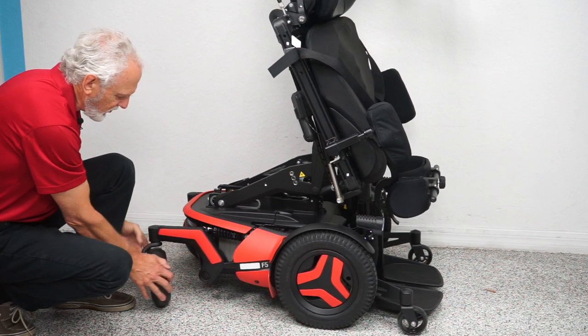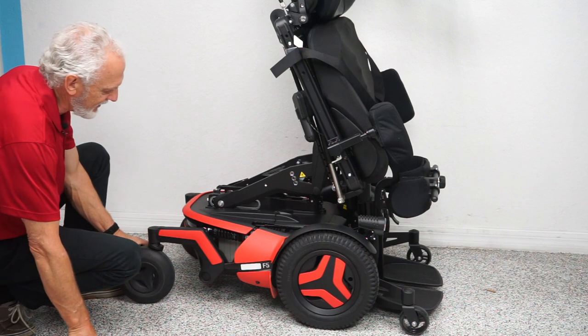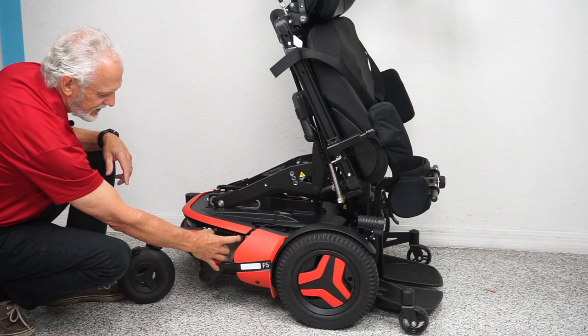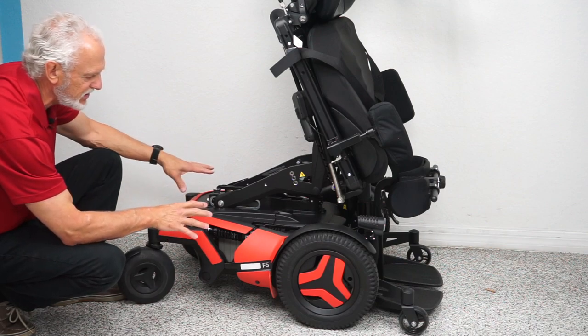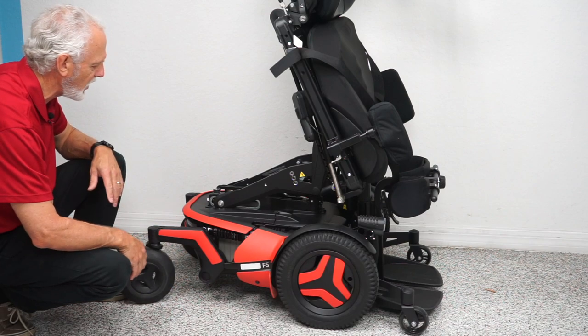You have caster wheels in the back. There's suspension here and here — look at the size of that suspension. It's adjustable by turning this ring, and you have four of these shocks around the chair. With the weight of the chair and the suspension, this is why it gives such a good ride — it's an incredibly soft ride.